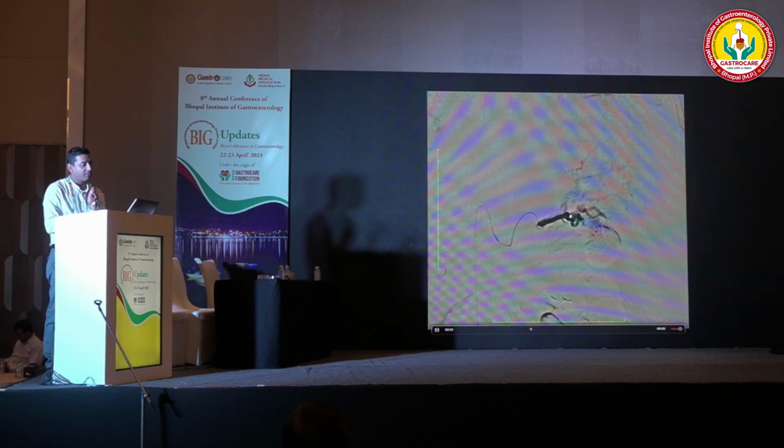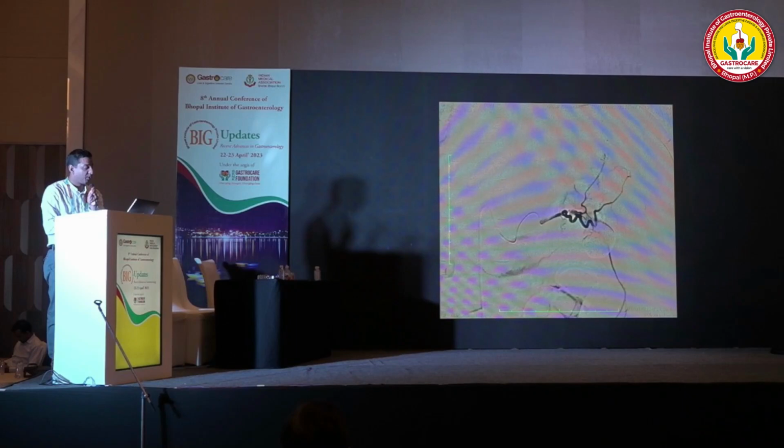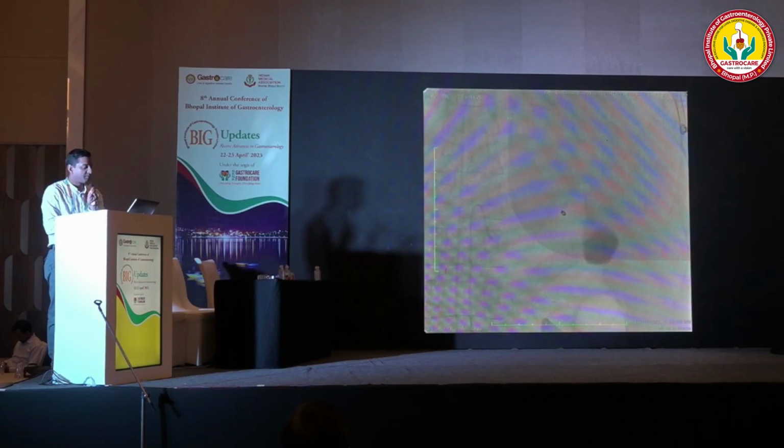Along with the aneurysm, some of the lower pole of the spleen also got embolized in this case. This is how we embolize the distal feeder. Now, to embolize the proximal feeder, we placed a coil in the proximal feeding artery, and this is the aneurysm showing complete stasis. There is no flow of blood into the aneurysm.